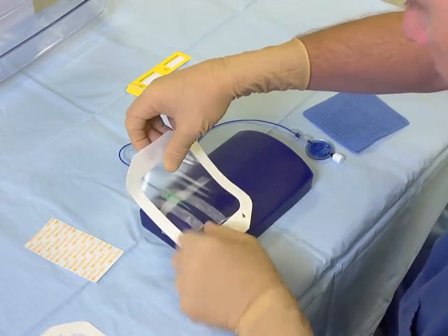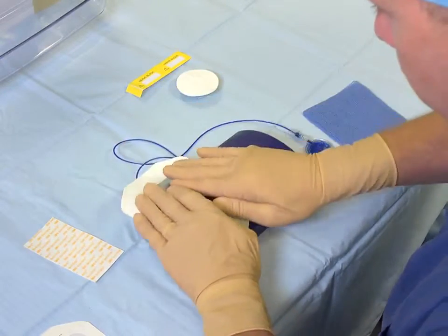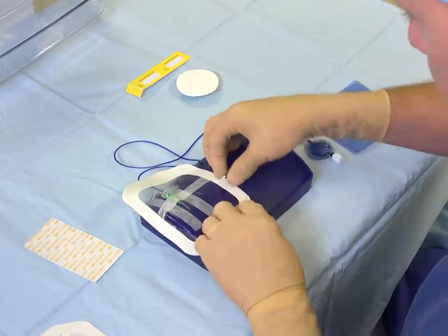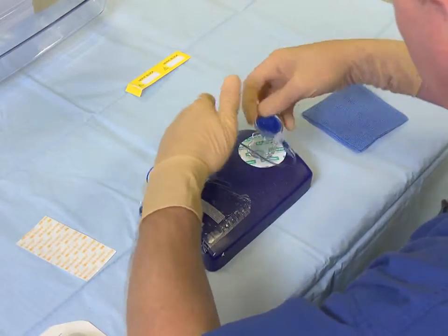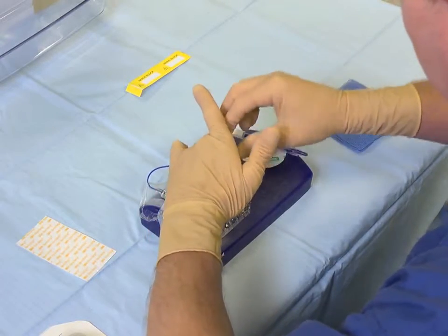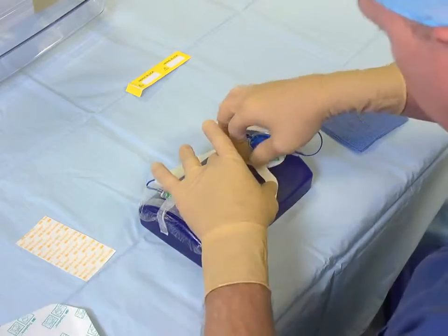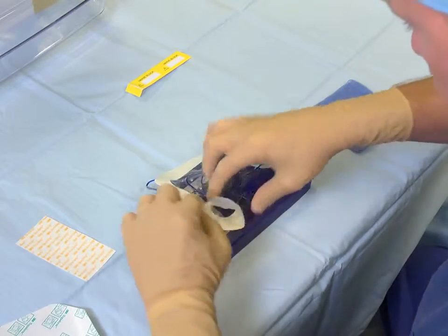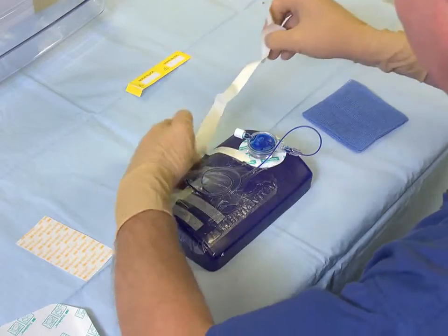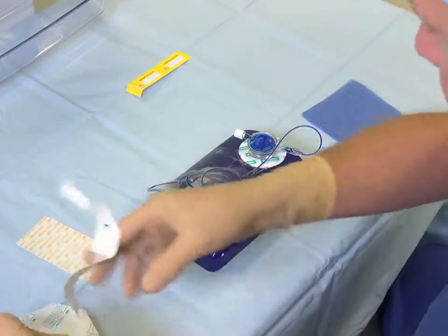A conventional Tegaderm dressing over the top, ensuring that the entry point is visible. Use the fix-along system to fix the filter into place. My preferred method is to put a secondary Tegaderm over the coil of the infusion line.